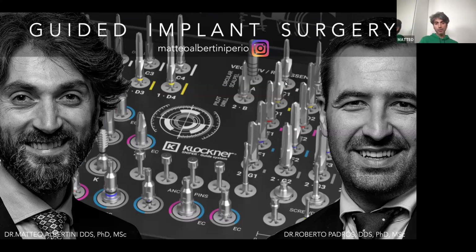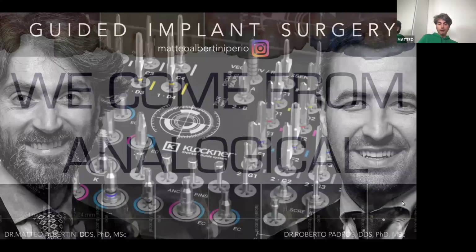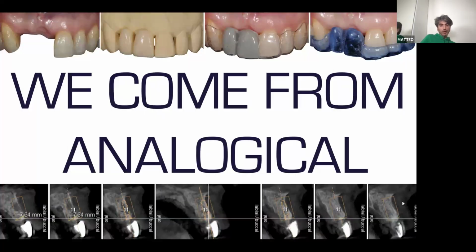Okay, so we're coming from the past, the analogical protocols for implant rehabilitation. And we all know this classical protocol: to have dental loss, so an edentulous ridge.